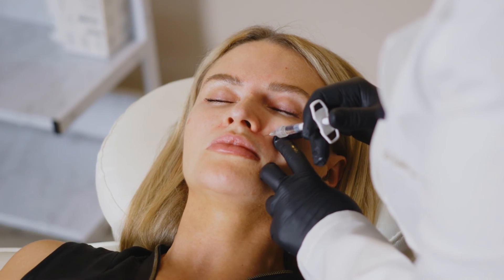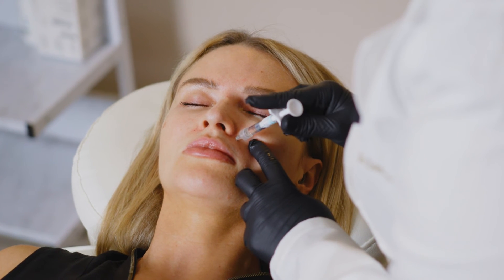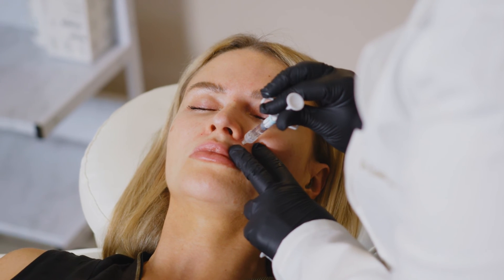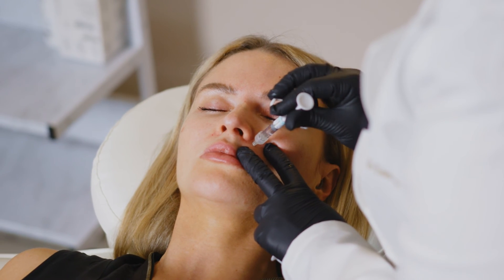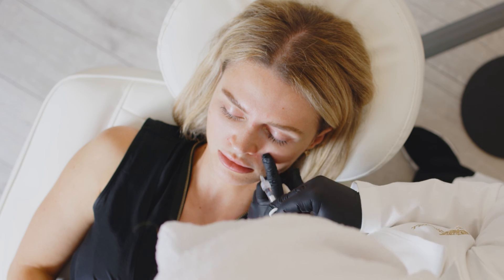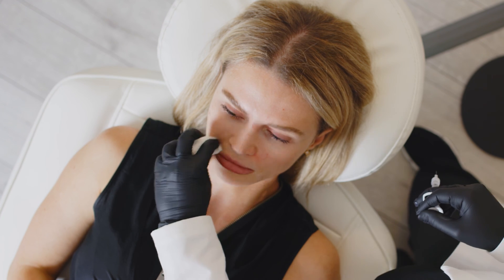Do the same here. Aspirate again. While keeping the firm stop on the bone, approximately 0.2 ml of filler was injected and we have a correction of the piriform fossa.